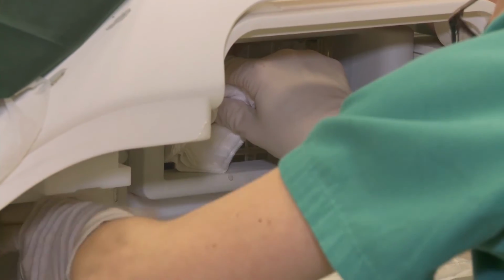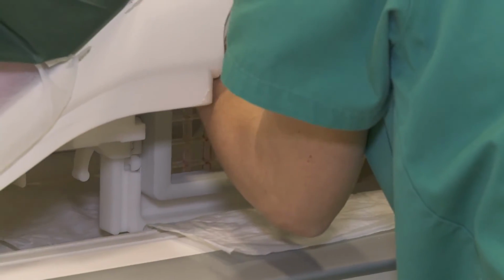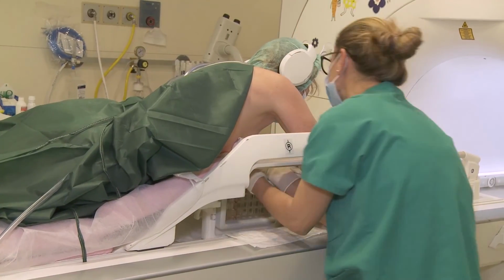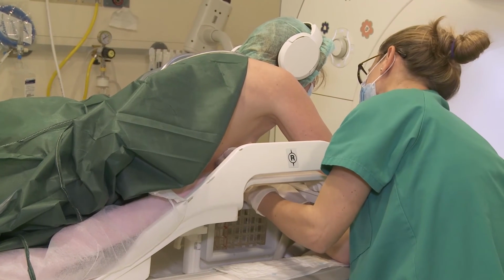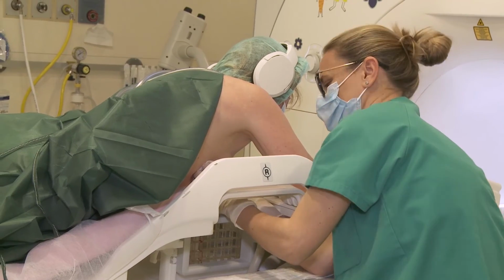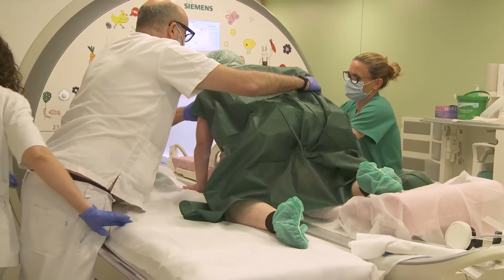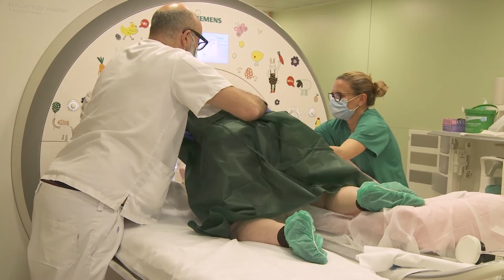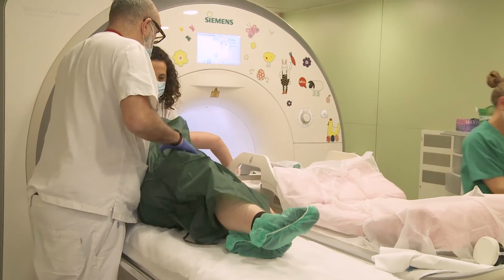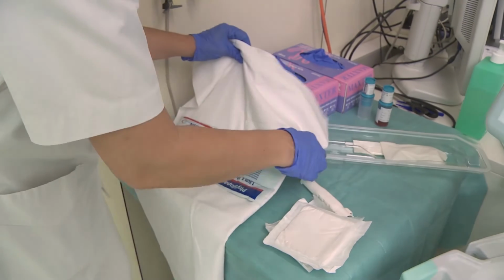The patient breast is released and breast compression is applied to avoid bleeding. Manual compression and cavity drainage maneuvers are done in the biopsy area. Ice is ready to be placed over the patient breast.